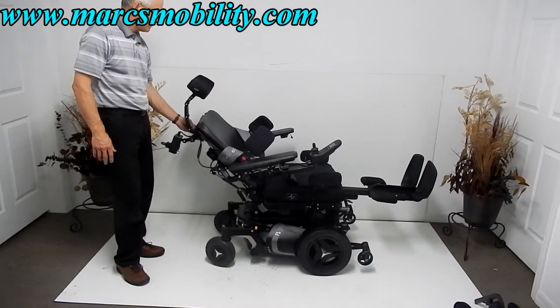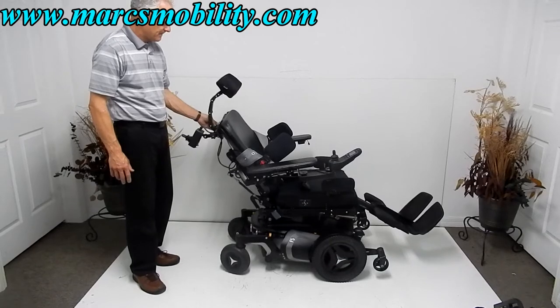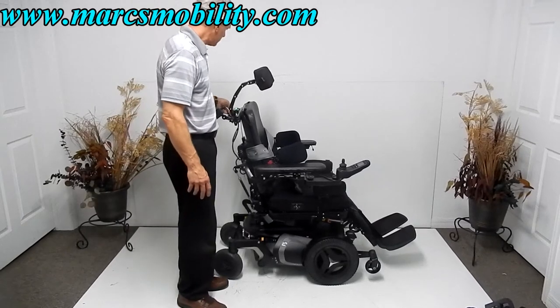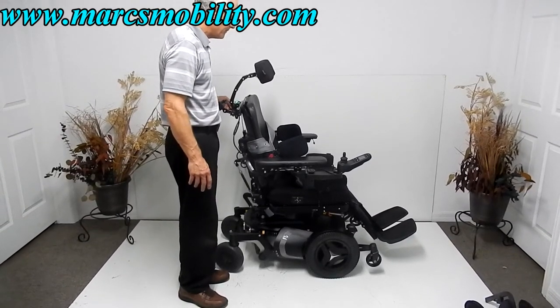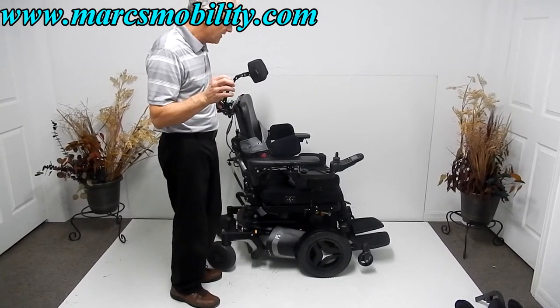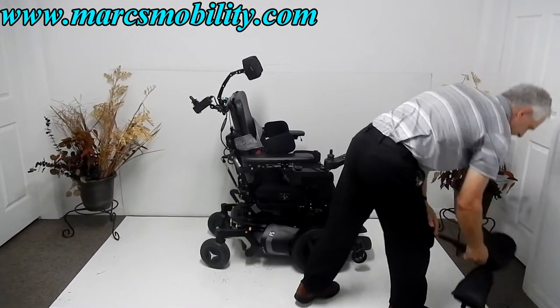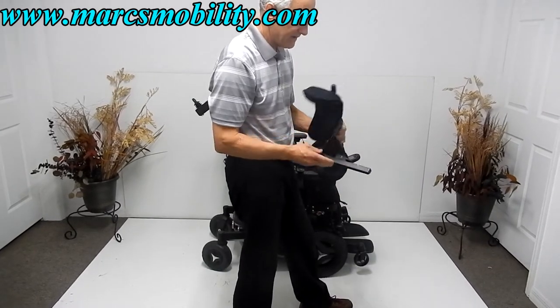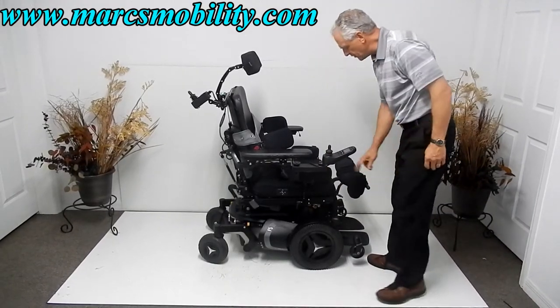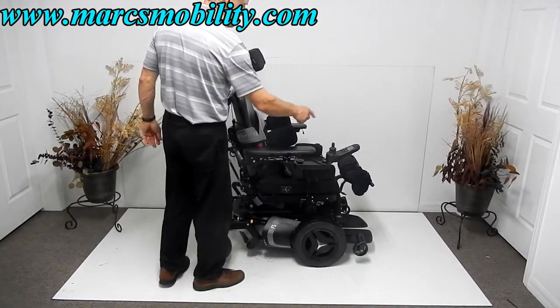I'm bringing the legs back down and the seat back up. Now I'm going to show you the standing feature. When you use the standing feature, you need to put the knee brace on. This is the knee brace, which is adjustable in height. It snaps on in front of your knees, and you've also got the chest belt.